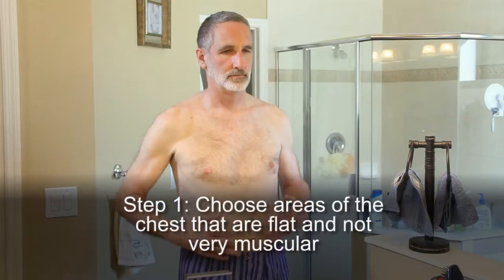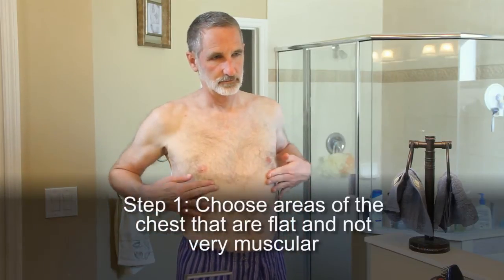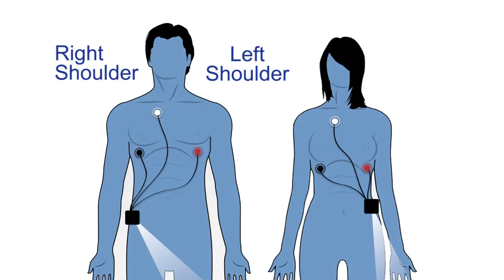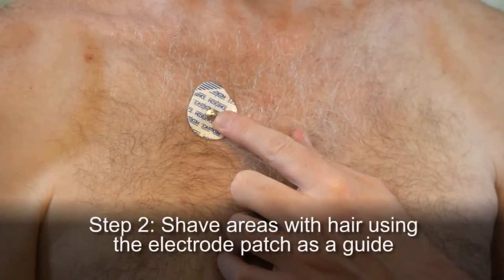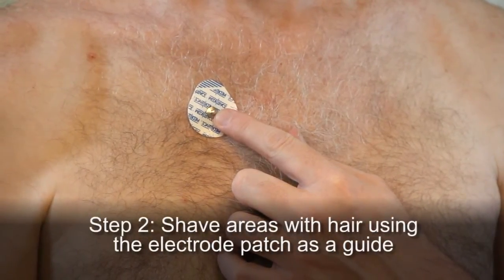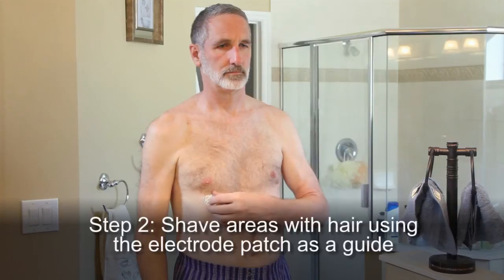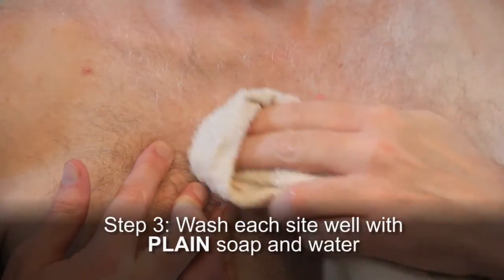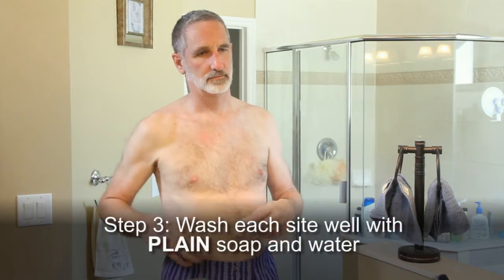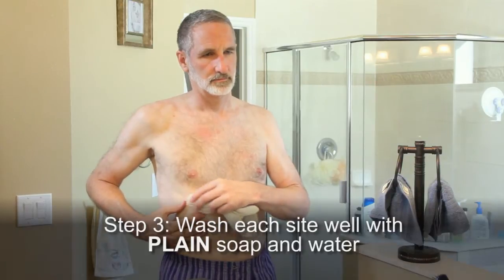Step 1: Choose areas of the chest that are flat and not very muscular within the areas indicated on the illustration. Avoid skin folds or creases, irritated skin, and scars as best as possible. Step 2: Shave areas with hair, using the electrode patches as a guide for the size of area to shave. This ensures good contact and makes electrode removal easier. Step 3: Wash each site well with plain soap and water. You should not use soap that contains lotion or oil. Dry thoroughly.